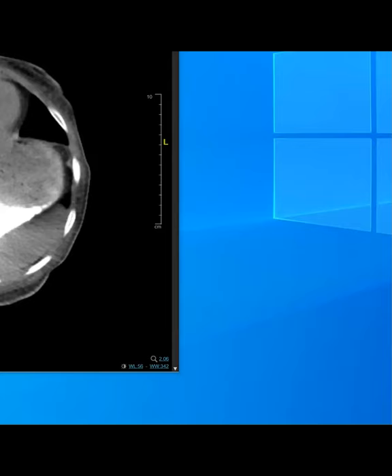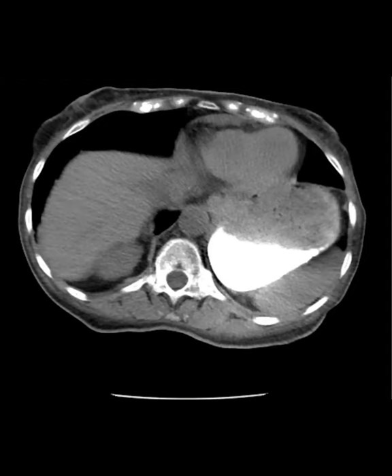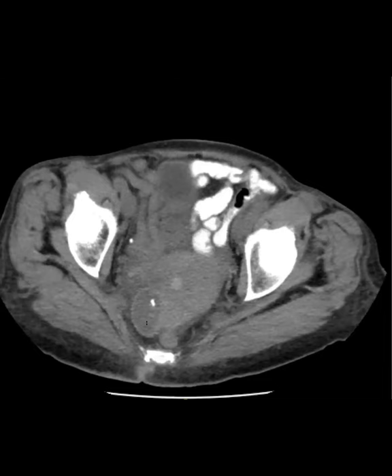All right. So this is a case of a woman in her 60s who developed weight loss, anemia, and hypercalcemia. So they did a pan scan to look for occult malignancy. There was nothing in the chest, and in the abdomen there wasn't that much either. It was a non-contrast, but then you get down to the pelvis, and there's this structure here. It looks cystic, and then there's this very coarse calcification.